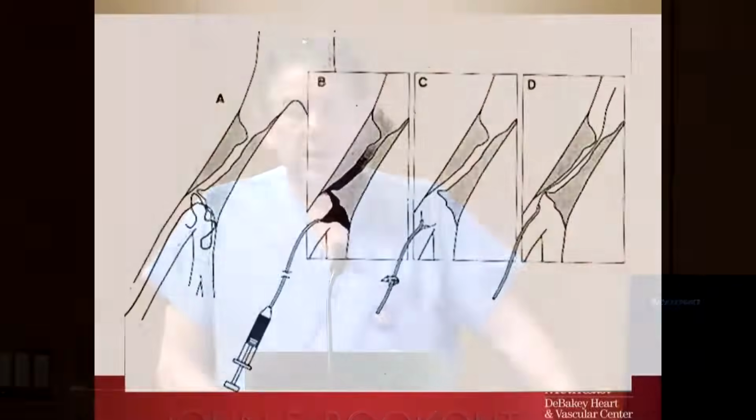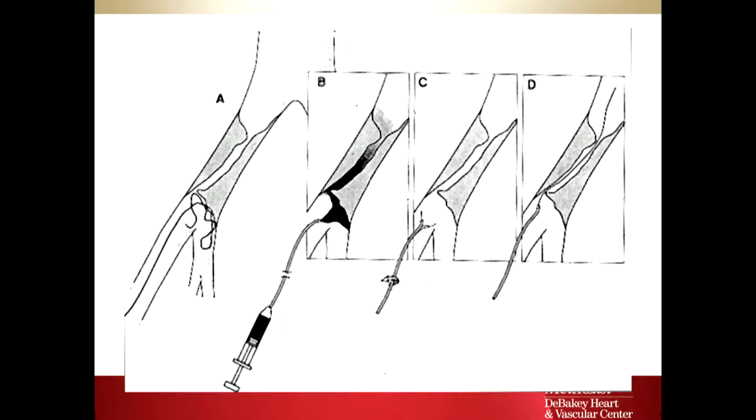It's when you've got a sheath that you can inject dye through, which is a little bit bigger than the catheter, and a wire. That's really the platform that you're going to use for setting up a lot of these lesions. Now, there aren't any stenoses in these models upstairs.